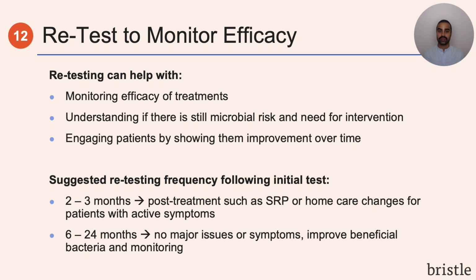So for this patient, we've gone through their baseline test, we've reviewed the test results, and we've implemented the treatment plan. So the final step is to retest. Our guideline for retesting patients is anyone with active symptoms or disease, retest them in 2 to 3 months after treatment, for example, scaling and root planing, or even any home care changes. And this time allows the microbiome to stabilize so you can truly assess progress and understand what their new baseline is. If the patient was generally healthy, you might end up retesting them yearly or every 2 years just for monitoring purposes.